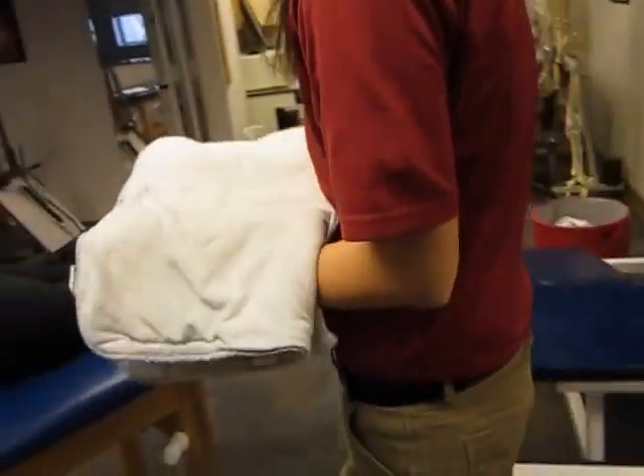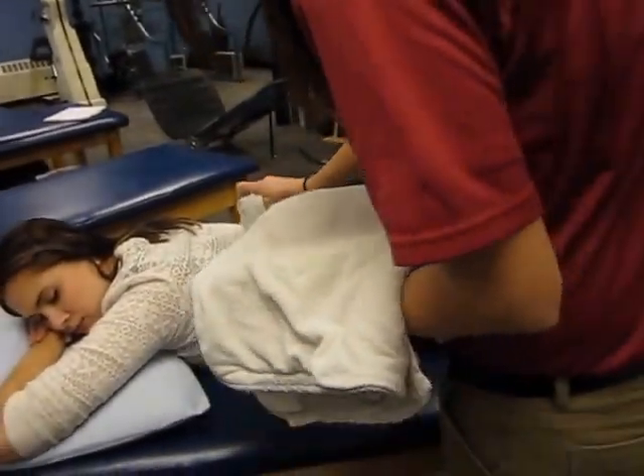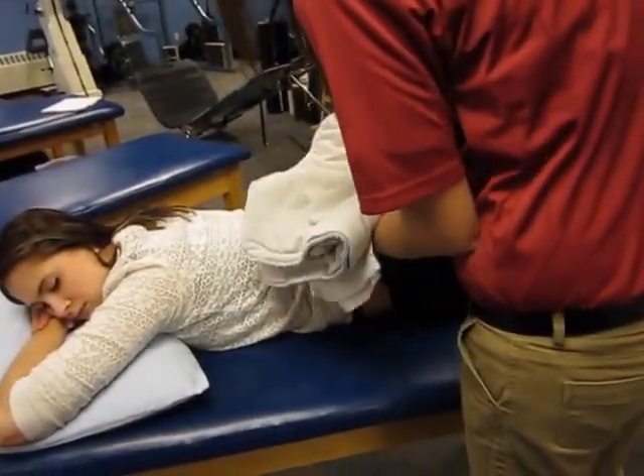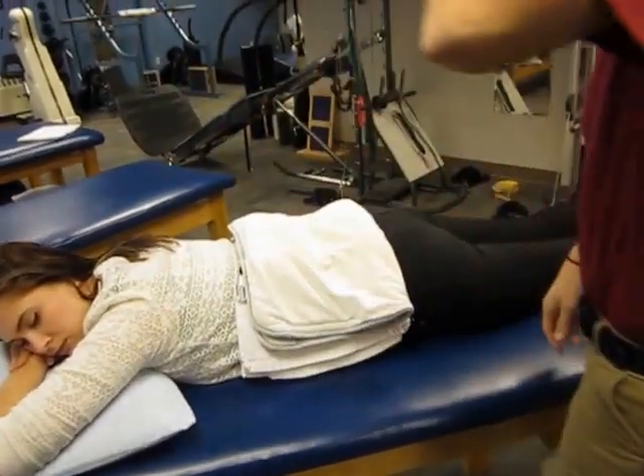After checking with the patient for any reasons where you may be concerned using the hot pack, such as any lack of skin sensation or any allergy to heat, the treatment time is approximately 15 to 20 minutes.